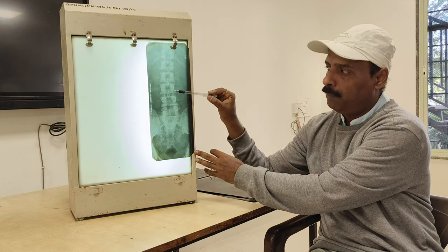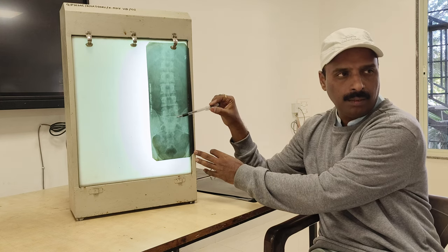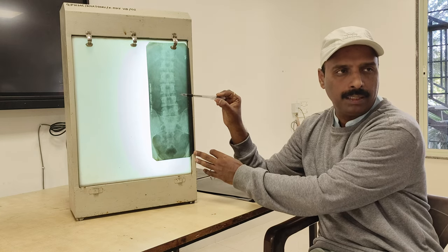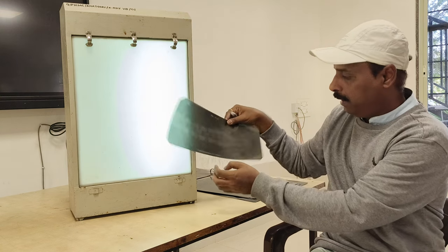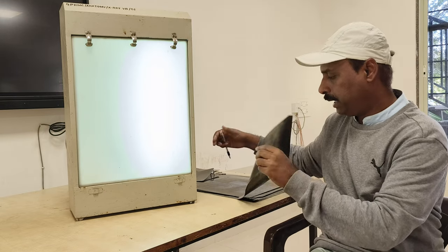To see the lumbar region or highlight the lumbar vertebrae, at that time we take this x-ray, which we call the plain variety of x-ray. So this is the one which you should remember. Then this is all about the first variety of x-rays.